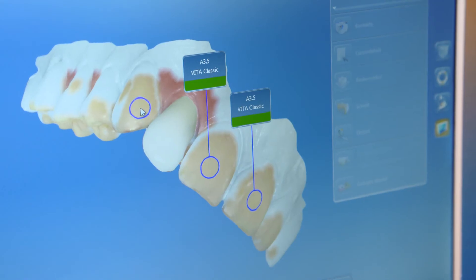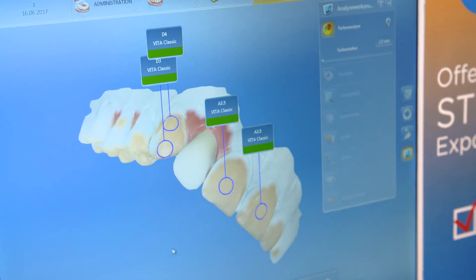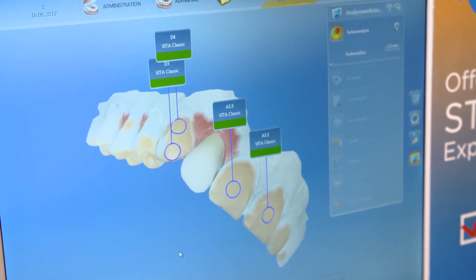It's going to save you time when choosing which color block you need. It's going to be awesome — it's easier. We are making all the treatment in one machine, so I don't need to have other things in my office to determine the color.